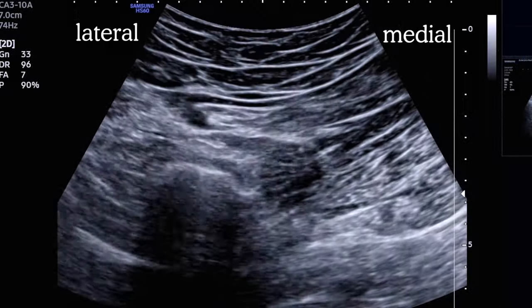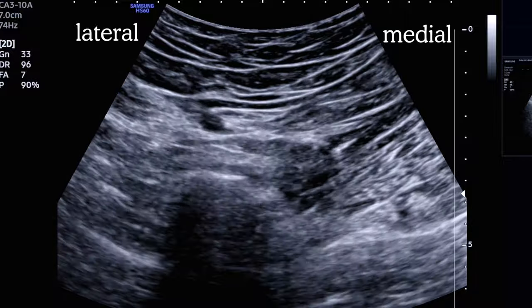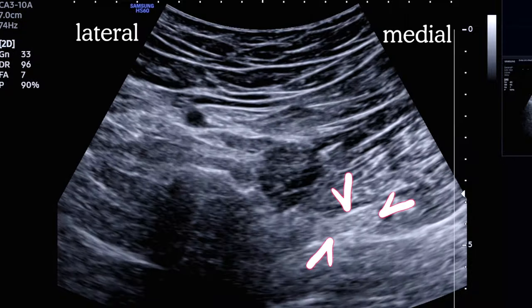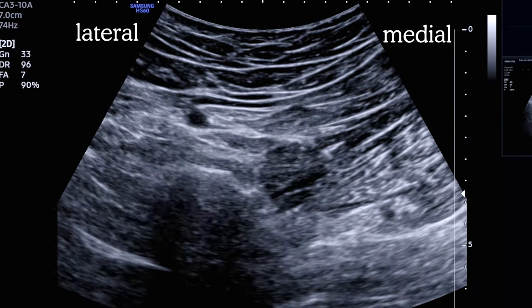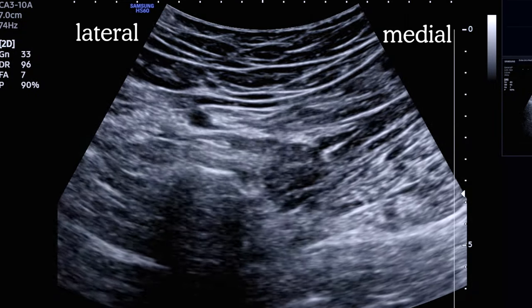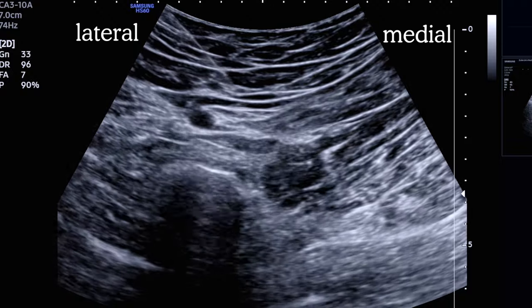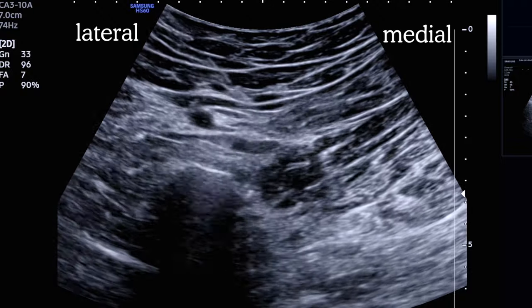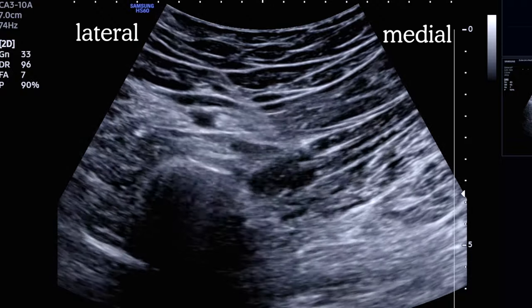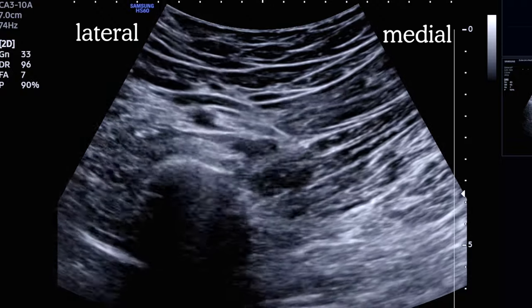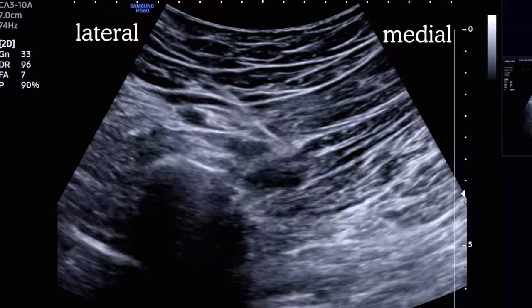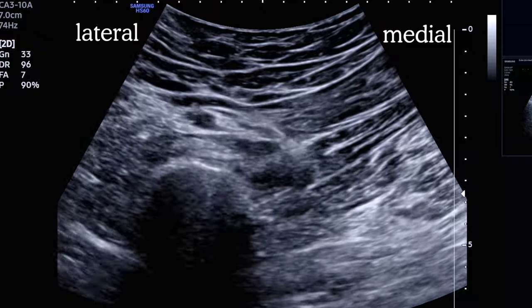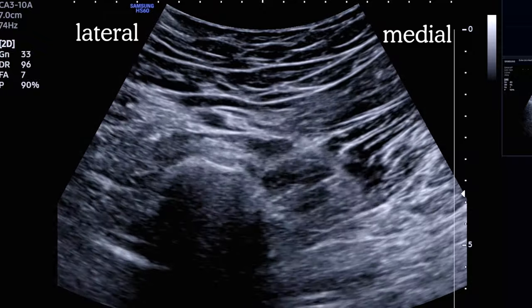Let's see the in-plane approach. Here's our hyperechoic sciatic nerve at about 5 centimeters deep. The needle can be seen advancing from the lateral aspect. Sometimes the nerve is just not that obvious, and for that reason we routinely use nerve stimulation as an adjunct to both find the nerve and to make sure we don't end up too close.